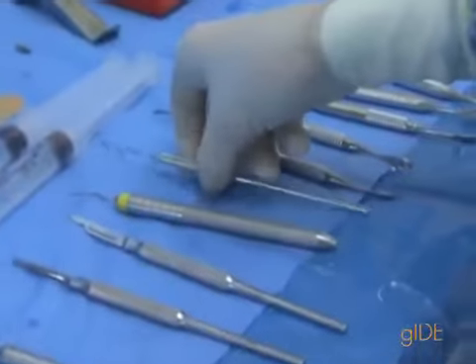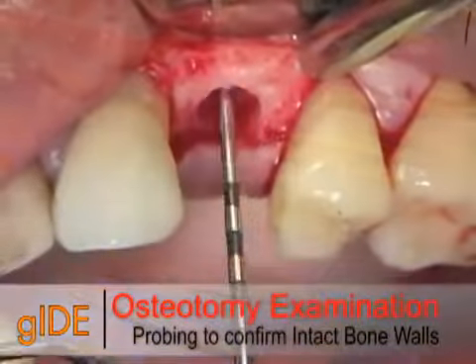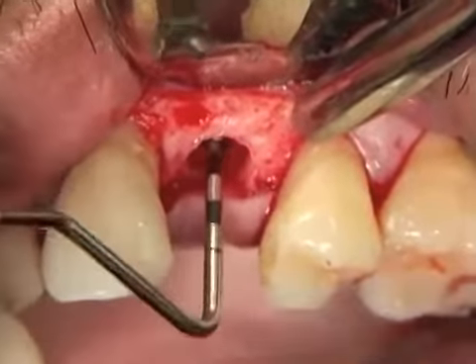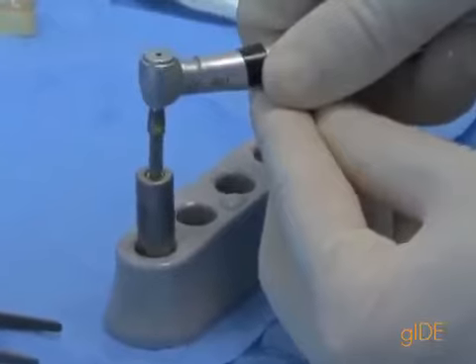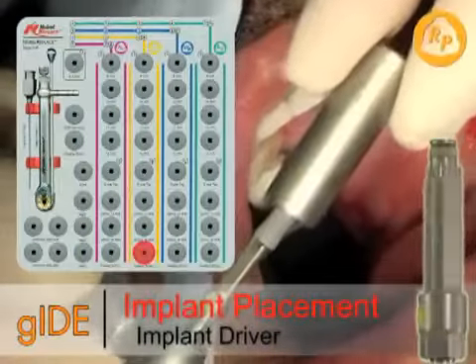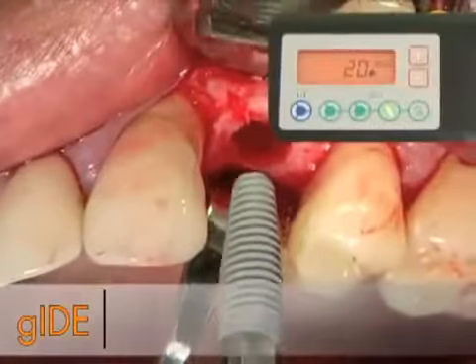An instrument is used to confirm that the bone osteotomy and the bony walls are intact and no perforations or anatomical limitations are there. Then the implant is picked up with a long shaft implant driver. The implant is pulled out of its titanium sleeve and then positioned in the osteotomy.